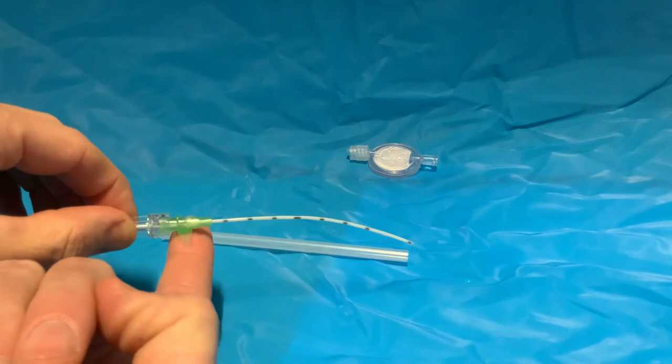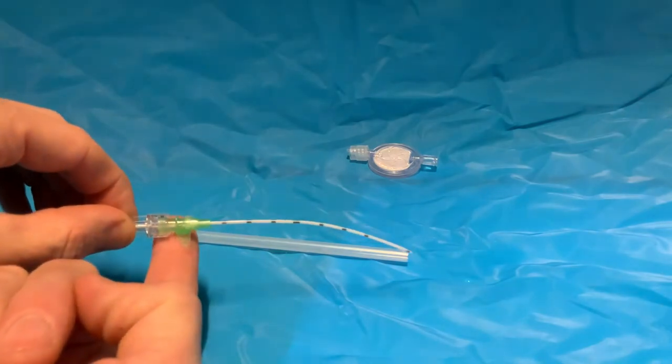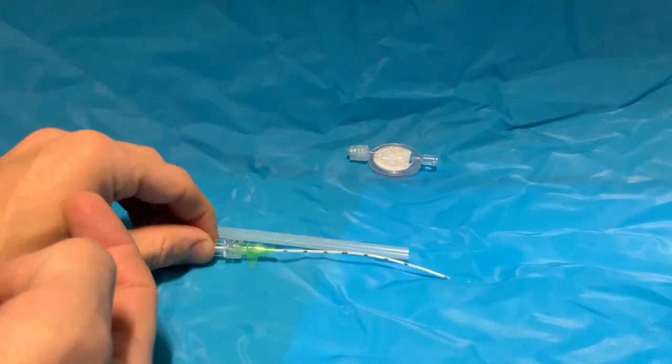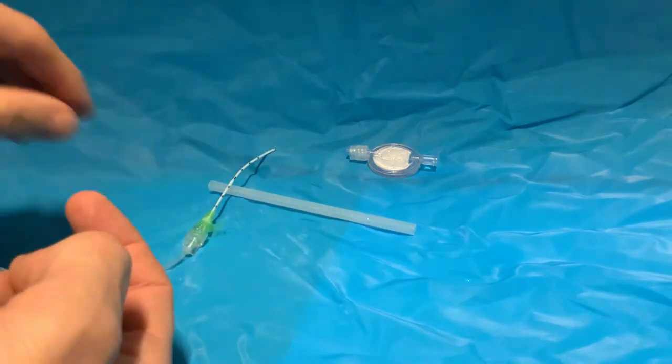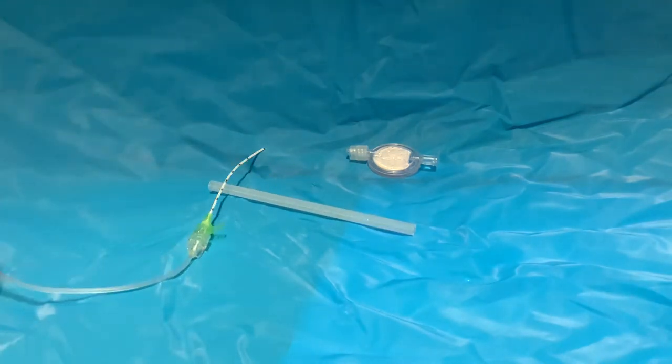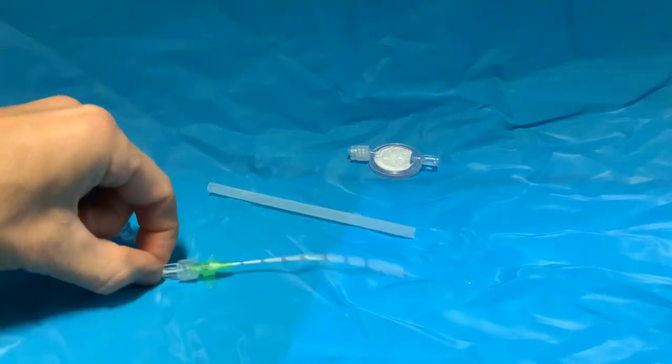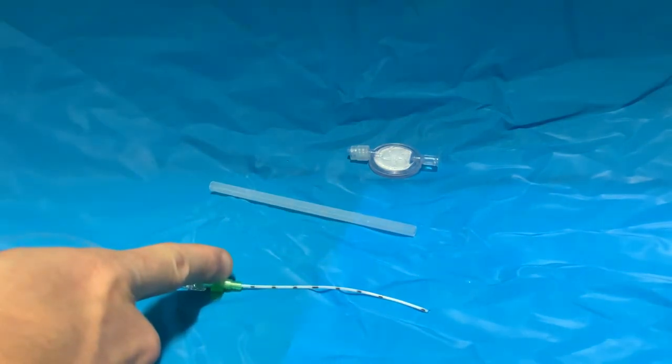A little bit of opsite underneath here, padded opsite, to protect the skin is a good idea. Generally, don't use skin glue in these because the size of the hole that you've created is sealed by the cannula.